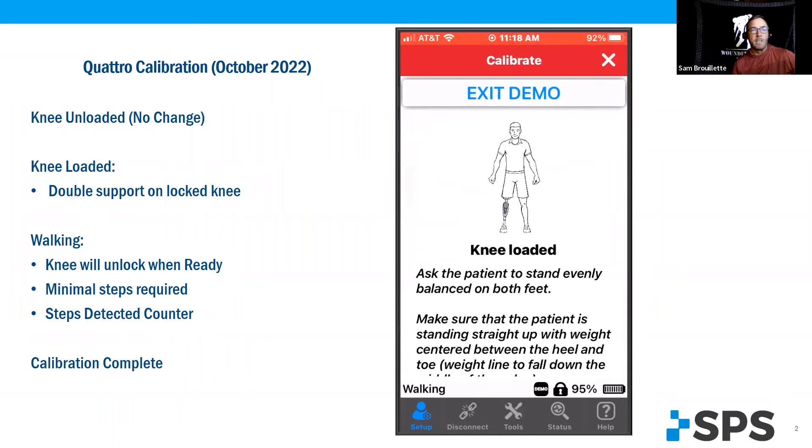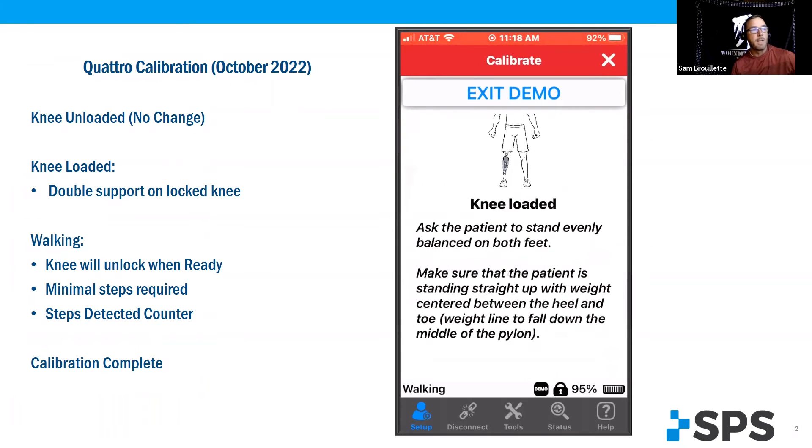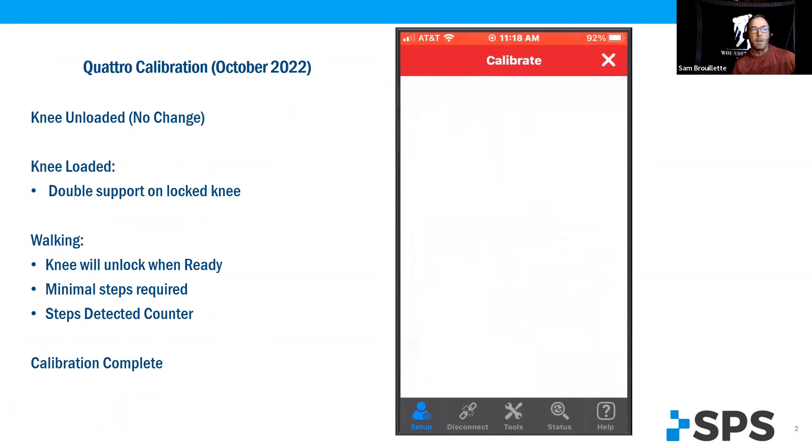Knee loaded has changed. Now it is double support on the locked knee, equal weight bearing. And when you're ready, hit ready and it will go to the next screen. Give it about two seconds and it will calibrate.